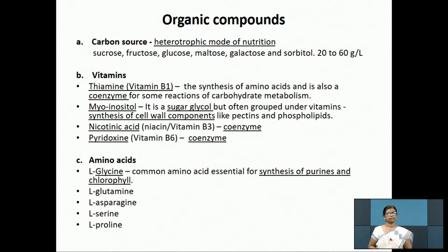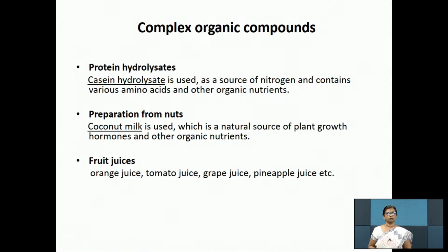And next are the amino acids. First of all, L-glycine. It is very important for synthesis of purines and chlorophyll. And then L-glutamine, asparagine, serine and proline are other amino acids which are added to the medium as organic compounds.